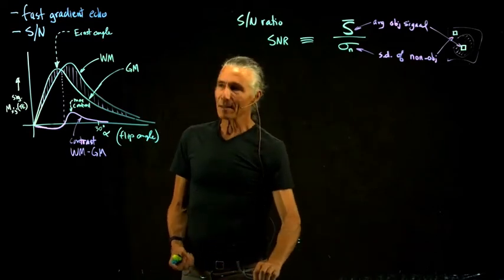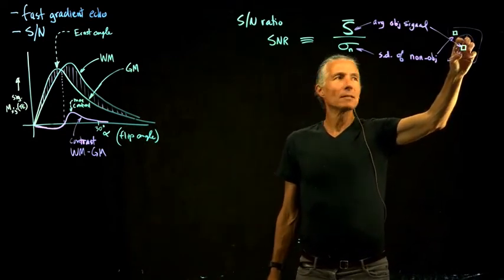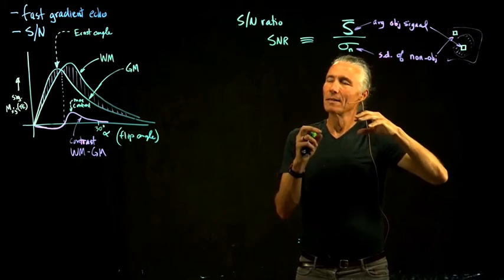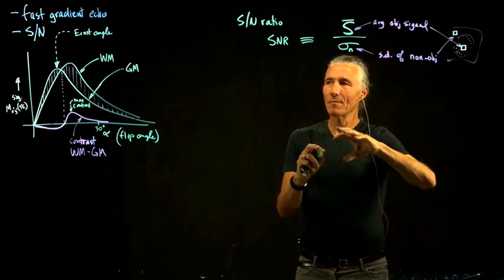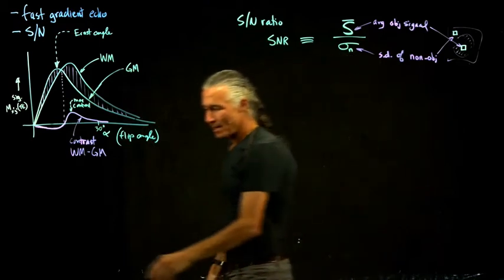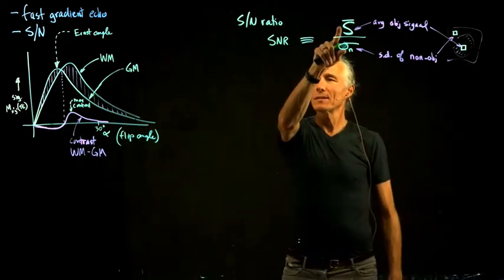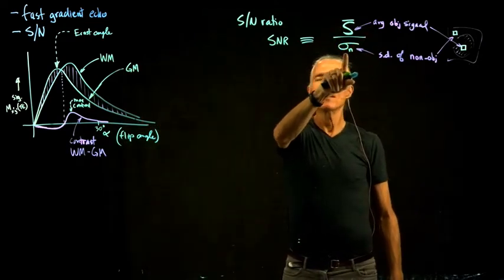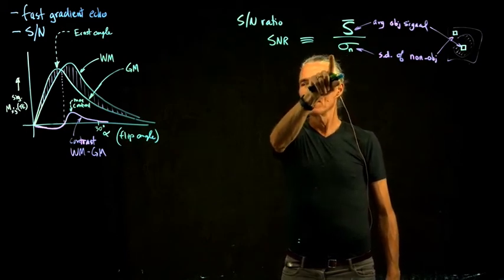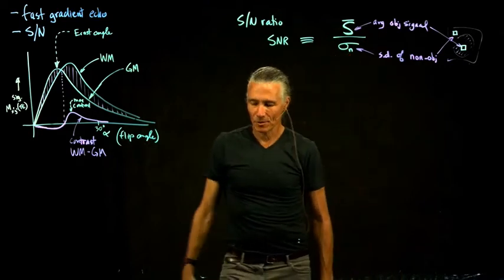You can see that's different than the signal, because you could have the same brightness image, but the background could contain a lot of speckly noise, or it could be pitch black and have very high signal to noise. So the noise would be very low. So that's our very simple definition. You average the pixel values somewhere in the image, and then you go out to the air where there's basically no signal, and measure the standard deviation of those values.